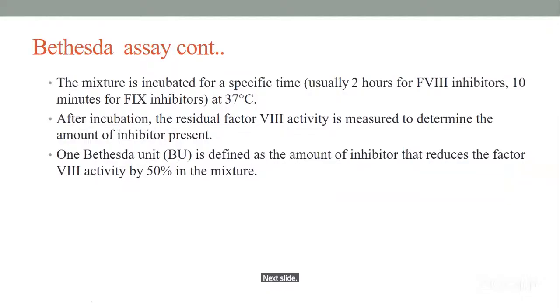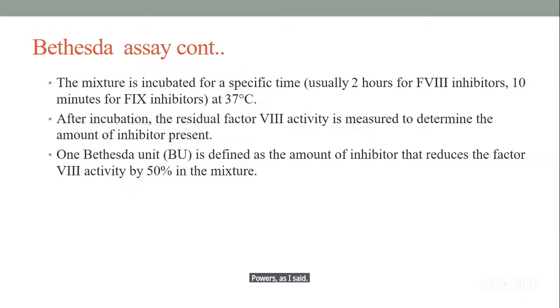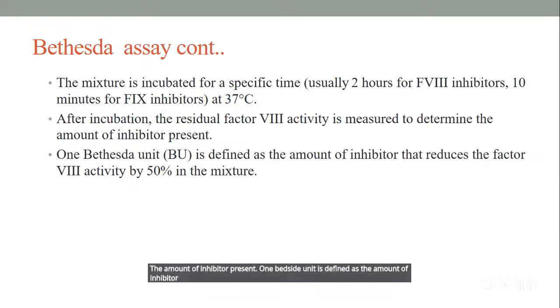Then, as the Bethesda assay continues, the mixture is incubated for a specific time, usually 2 hours for factor 8, and 10 minutes for factor 9, at 37 degrees Celsius. After incubation, the residual factor 8 activity is measured to determine the amount of inhibitor present. One Bethesda unit is defined as the amount of inhibitor that reduces the factor 8 activity by 50% in the mixture. Next slide.